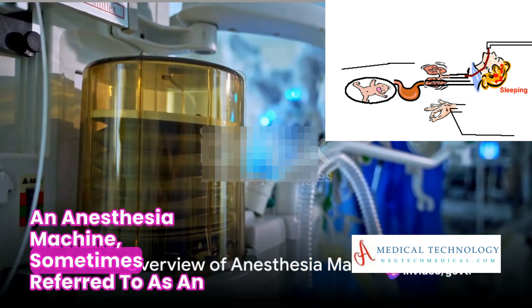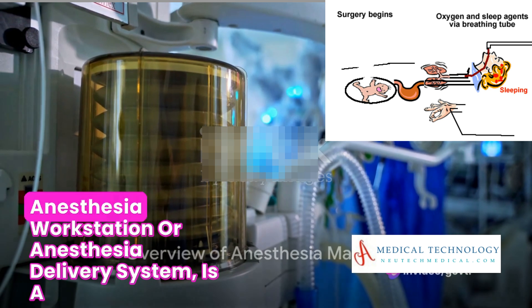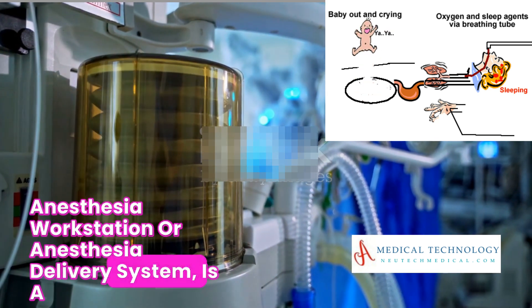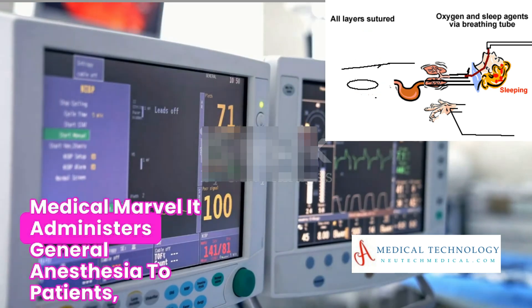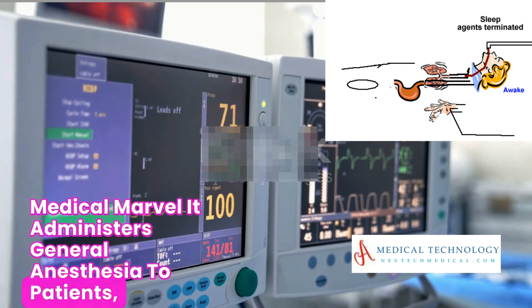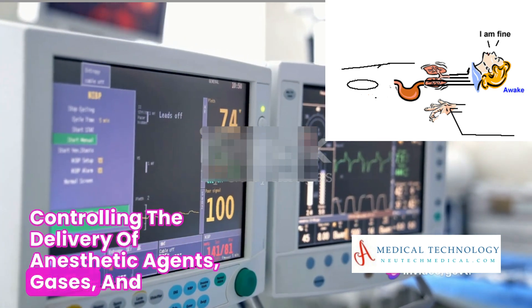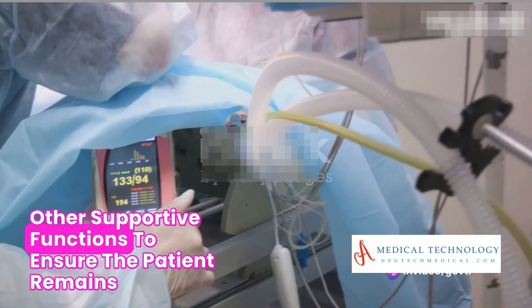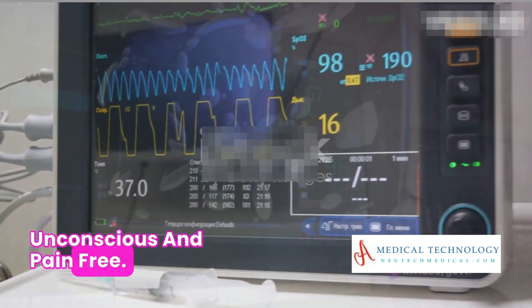An anesthesia machine, sometimes referred to as an anesthesia workstation or anesthesia delivery system, is a medical marvel. It administers general anesthesia to patients, controlling the delivery of anesthetic agents, gases, and other supportive functions to ensure the patient remains unconscious and pain-free.